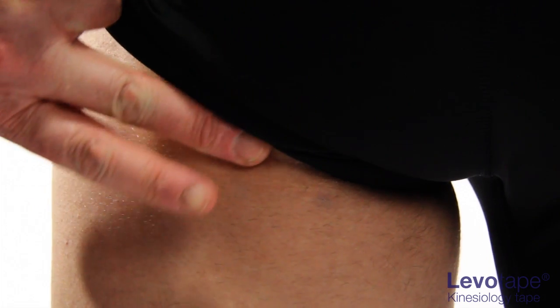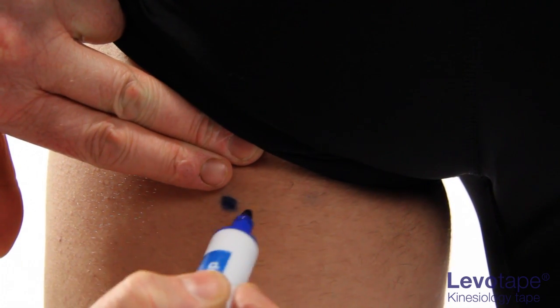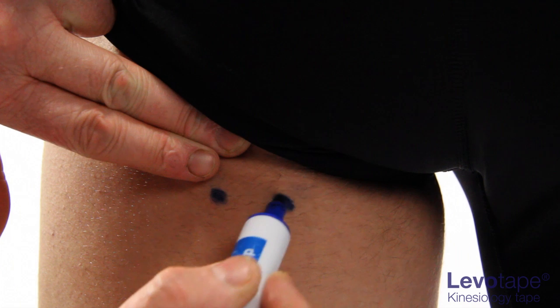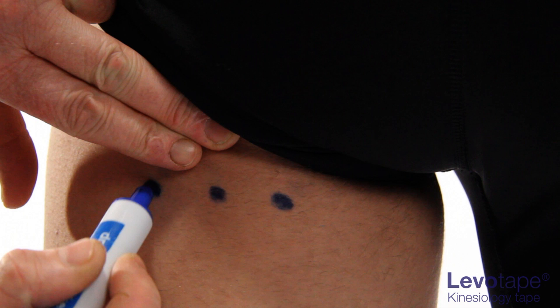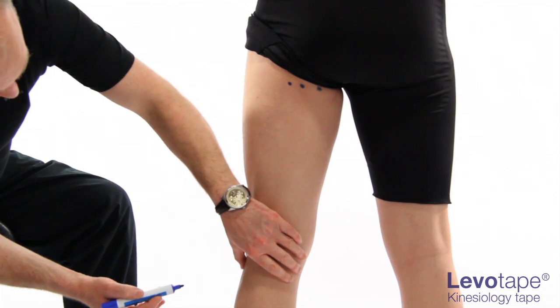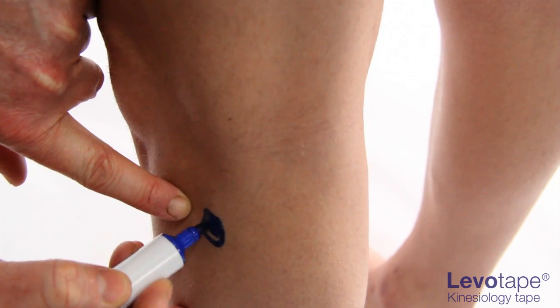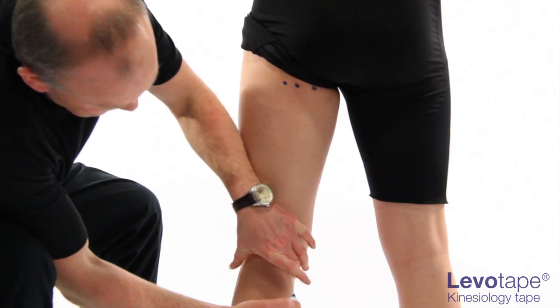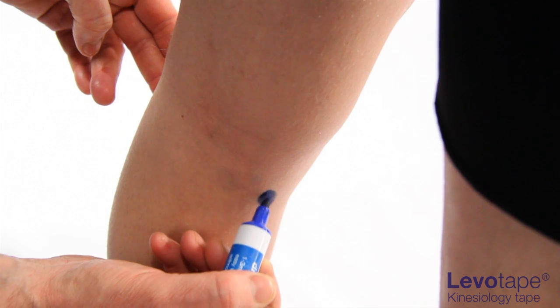Palpate the ischial tuberosity and mark 2 finger breadths below this. The base of the Y strip is placed 2 centimeters medially from this marked point. The base point of the I strip is placed 2 centimeters laterally from this marked point. The end point of the I strip is marked over the head of the fibula. The end points of the Y strip are marked at a corresponding level on the medial tibial condyle.